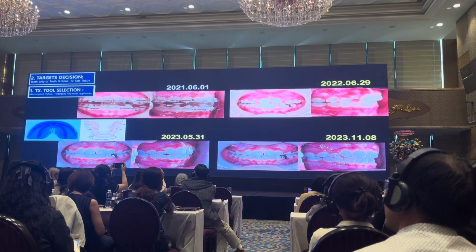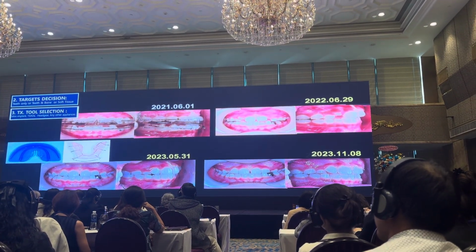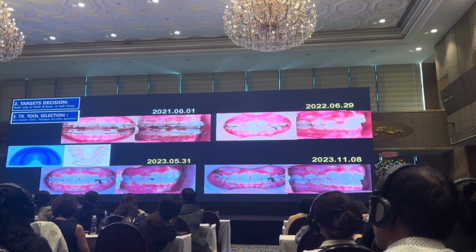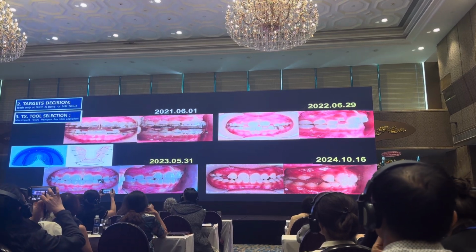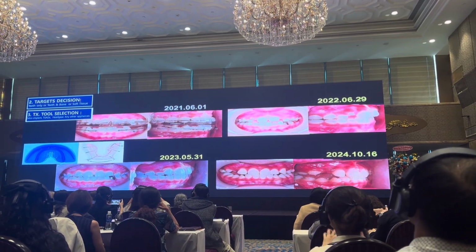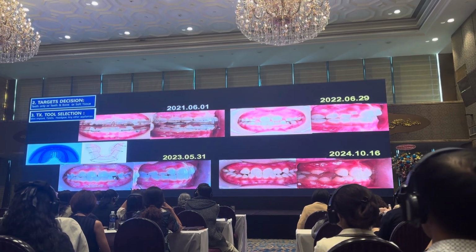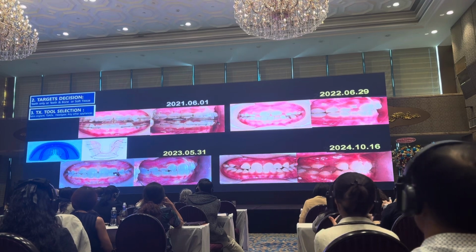And this patient showed improvement of midline tendency. And last month, I checked the data of the patient. Now, we do not use Clear Corrector. We only use the pre-ortho and tongue elevator combination for active control during the retention period.